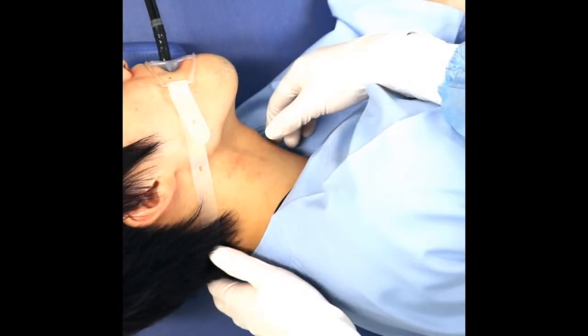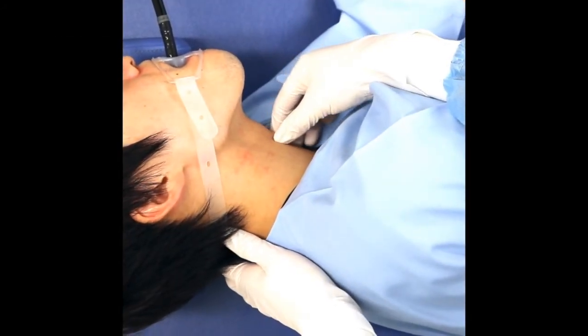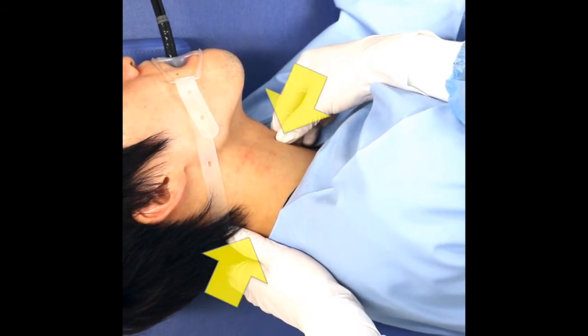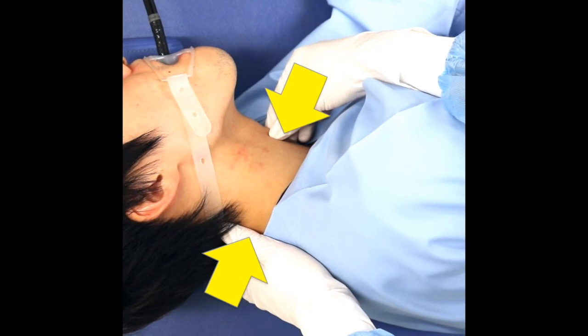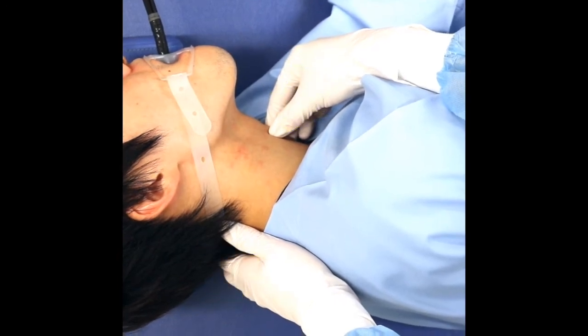With the patient in the left lateral decubitus position, we bent the head back, supported the back of the neck, and pressed the cricoid cartilage gently backward with a force of less than 20 N.